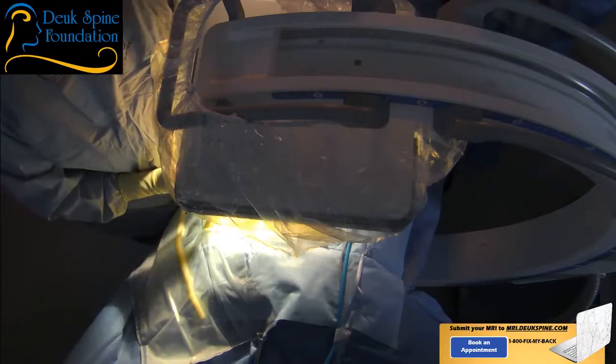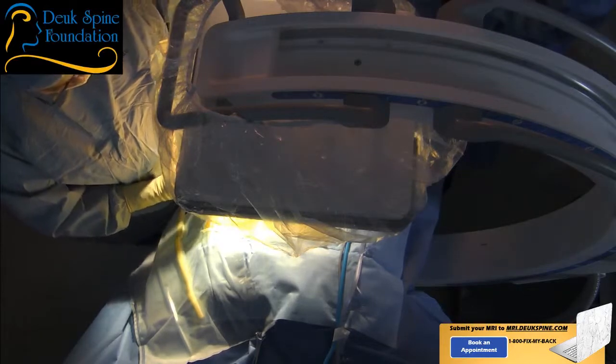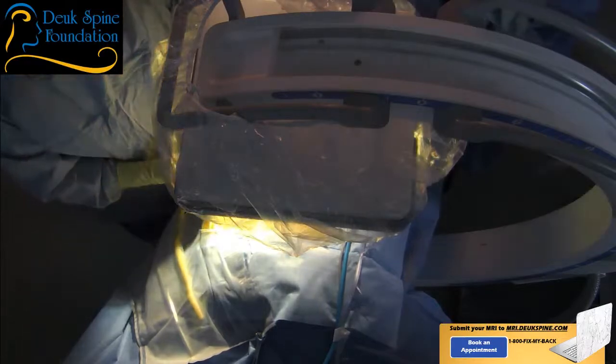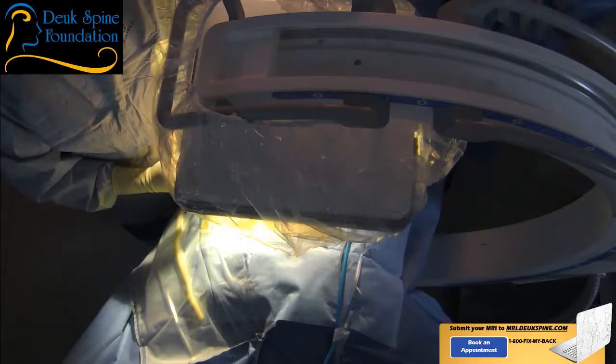You're going to feel a little more numbing medicine go in. I apologize. Is that better? A little bit? All right. Do a little biofeedback for you.